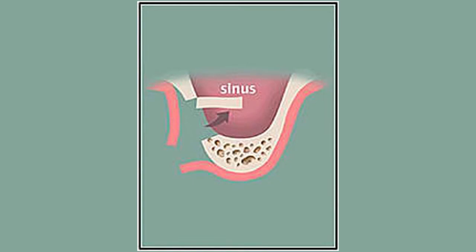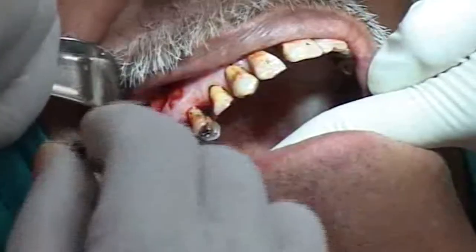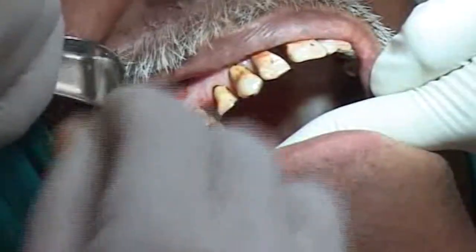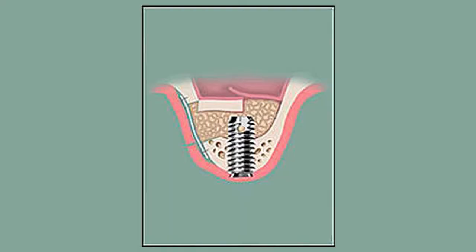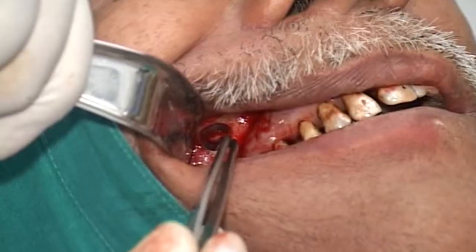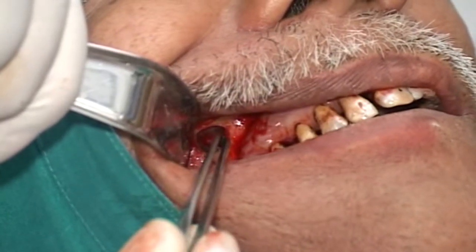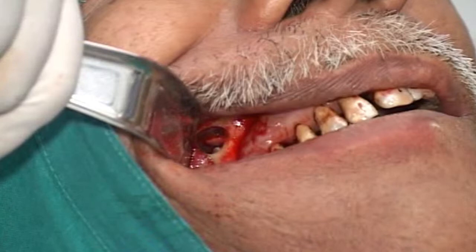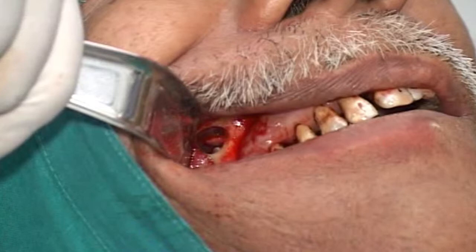We should position the bone piece as deep as possible — as shown in this picture, it should be in the horizontal position. Once that separation is done, we place the implant, and you can see the torque gained as the head moves. Once the implant is in position, we maneuver that vertical piece onto the implant. The horizontal positioning of this piece is of prime importance; it should be loose enough to be very easily kept on the apex of the implant. We can see very slight mobility when the patient breathes.